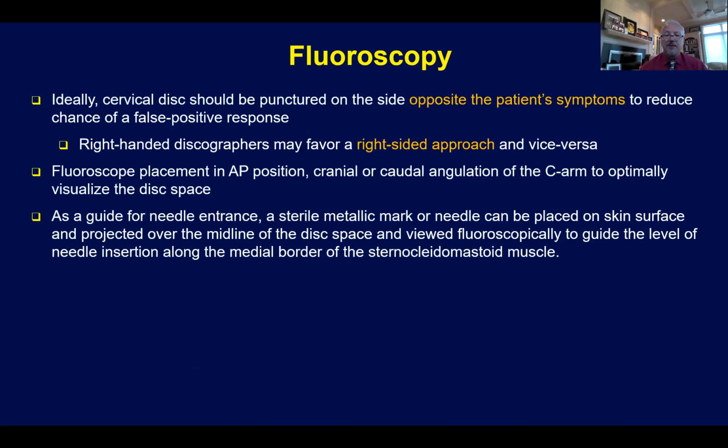We come in from the opposite side, although some authorities would, forgetting the fact that the esophagus is found most commonly on the left side and that entrance is most commonly performed on the right side, some discographers will enter the contralateral side from the patient's pain. So if the patient's having right-sided neck pain, they may come in from the left side, forsaking the fact that the esophagus is located mostly left. I typically favor a right-sided approach in most individuals.